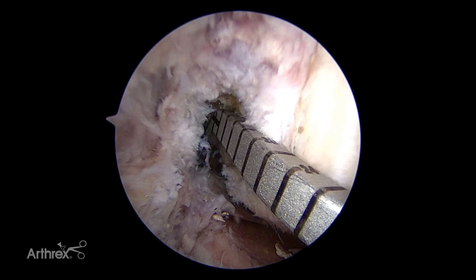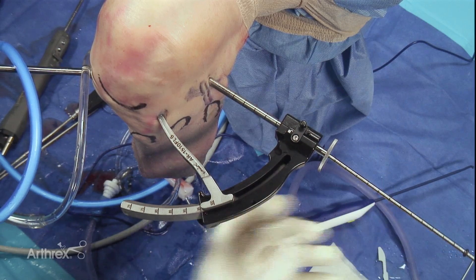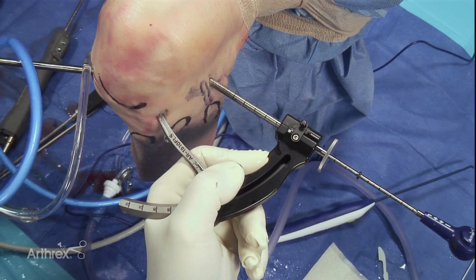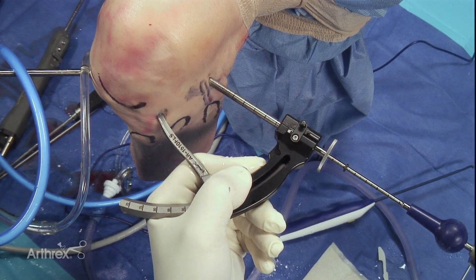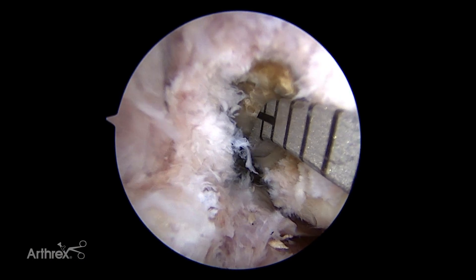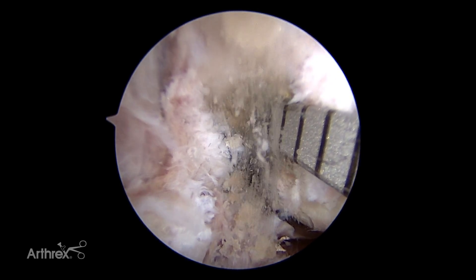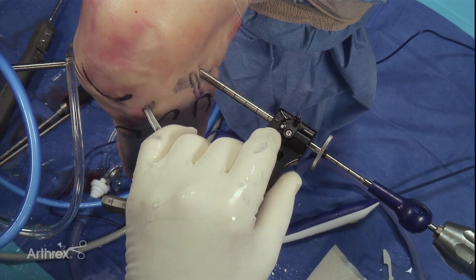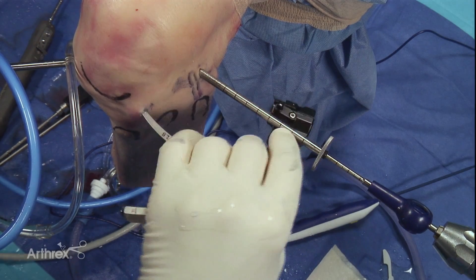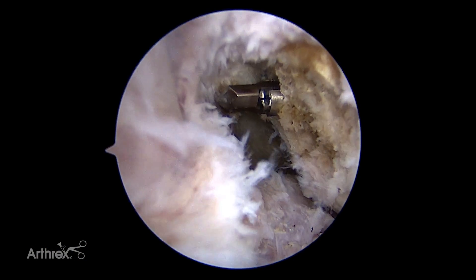But for today we're going to simply use the flip cutter and the guide because that's really what we're trying to demonstrate. And we can see here from an external view — notice I've got one hand on the drill and I don't have a hand on the guide right now, but I'm about to do that — and I'm going to drive in. Obviously we would be sizing the graft on the back table and selecting the appropriate flip cutter based upon that. So now that we're through, I can remove this, open it, and carefully look at the position. Here we can see the flip cutter in position.